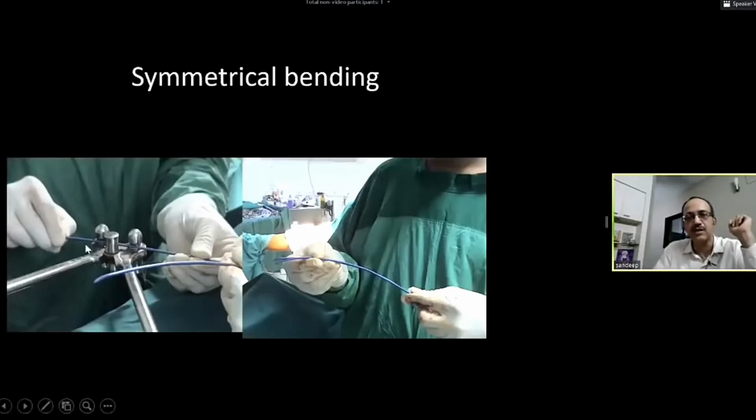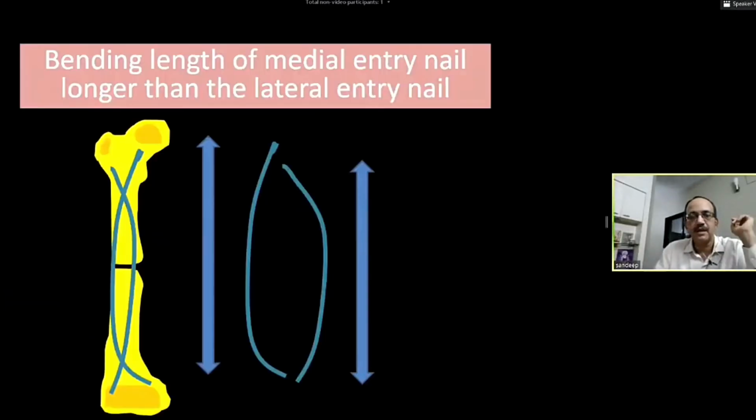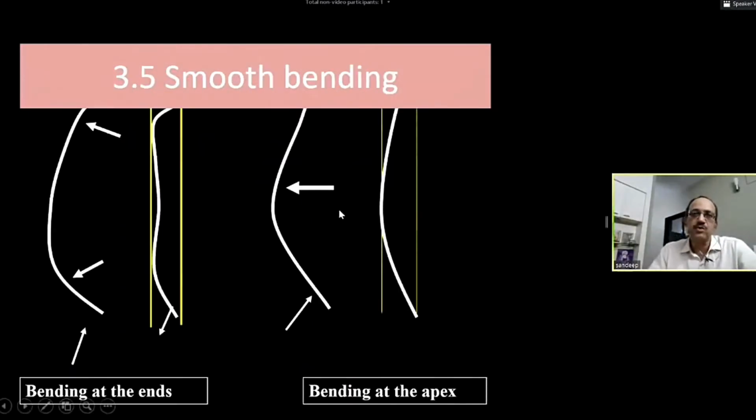Symmetrical bending can be achieved with the use of wire benders or plate benders if you have them available, or there is a handheld tool which you can use to bend the nails. But make sure that you are bending symmetrically. So these are examples. Now the medial nail is always a little longer because it goes to the neck region and it is bent on a longer arc of diameter. Just remember that the medial nail bending is usually more because it goes in more. Second, you must have smooth bending on either side. So bending should start from the apex and proceed symmetrically on either side.